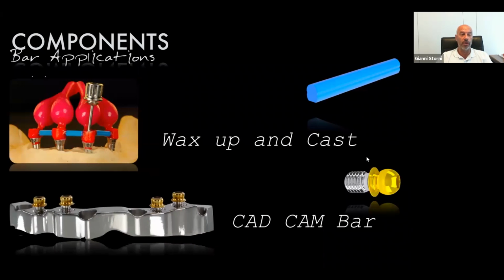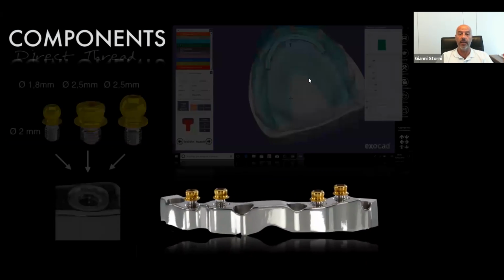Going also to the bar solution, we have the same story. We never forget the past. It's only about our needs and our technology. We can do a full wax-up technique using the traditional way to go, or a CAD-CAM solution, or a mix, as you saw before. So we can follow the way we want.